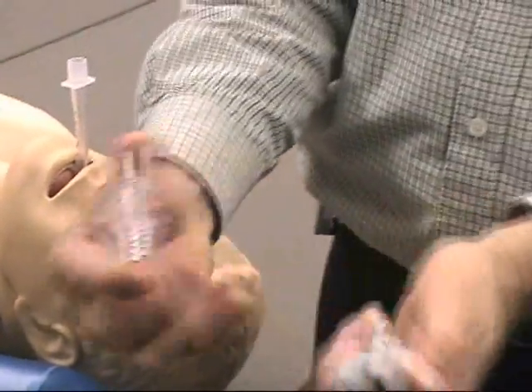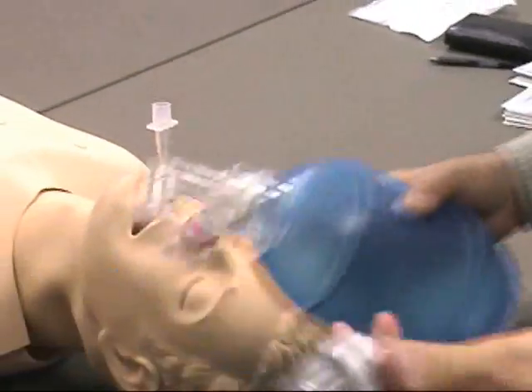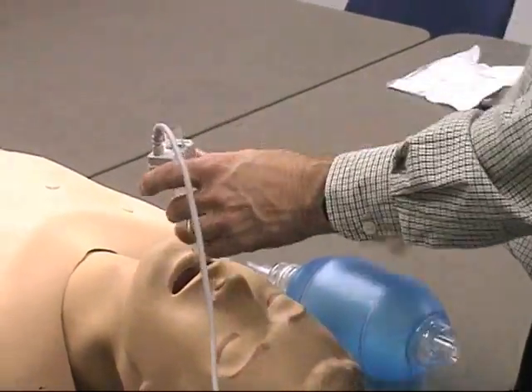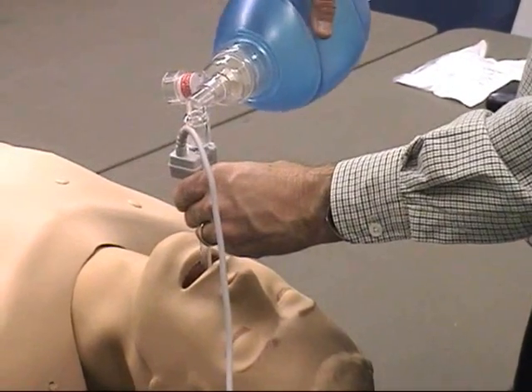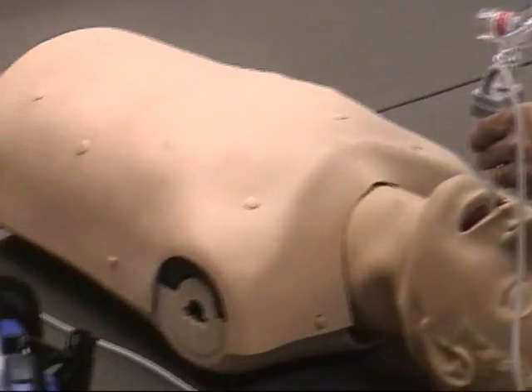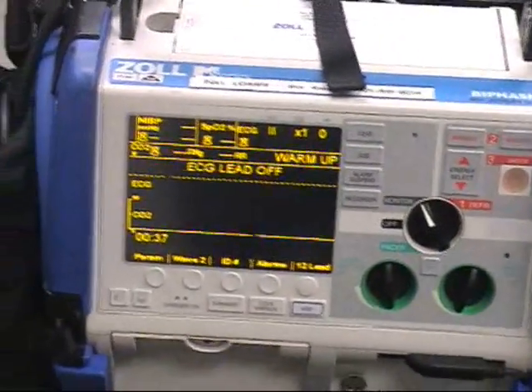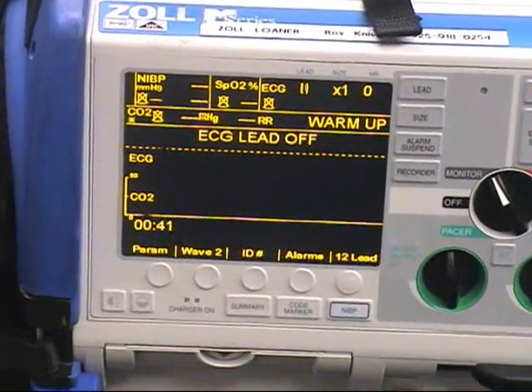With the clear airway adapter already attached in the sensor, we're going to attach this to the patient's ET tube and use the BVM, and now we can bag the patient. While we're bagging the patient, you'll see the waveform and the respiration rate show up on the screen.